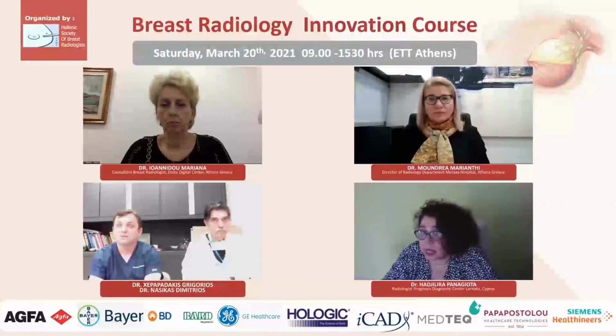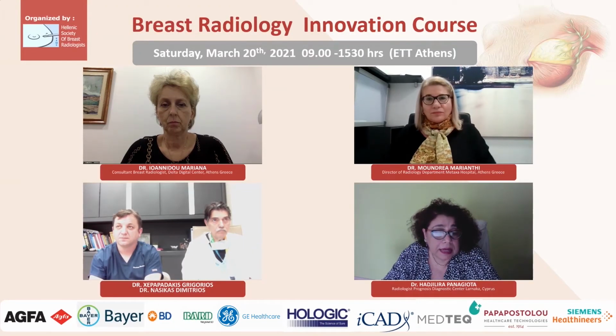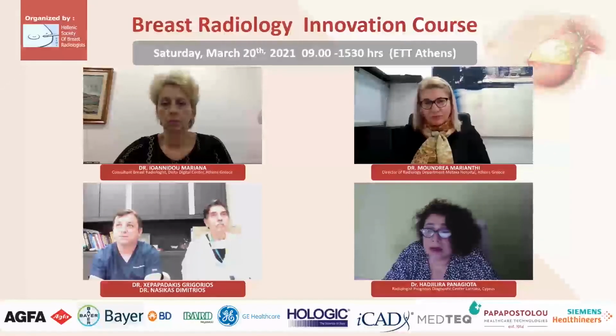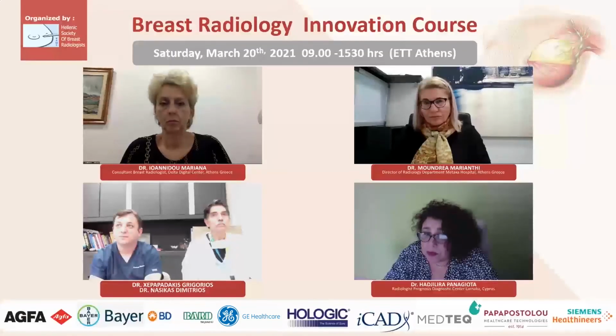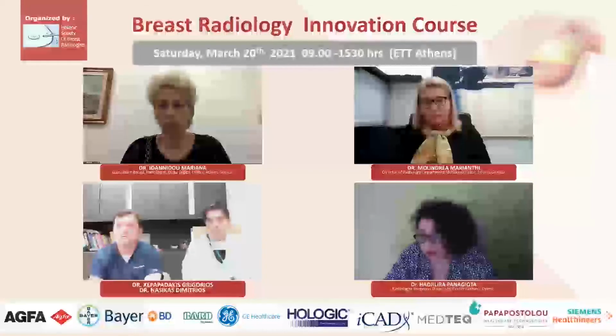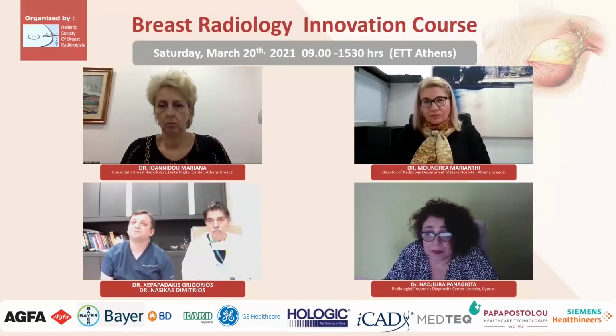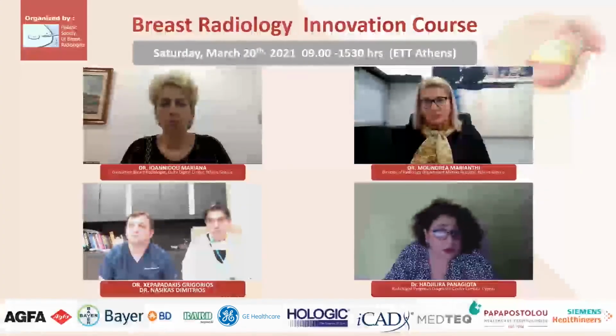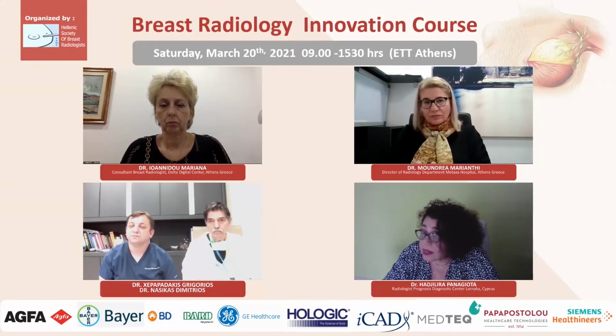We know the gold standard is the MRI, but it has the potential of delaying the diagnostic process. In contrast-enhanced mammography, the information can possibly be obtained in the first patient visit. This is such a promising idea. When MRI is not available or is contraindicated, contrast-enhanced mammography is a very useful alternative.